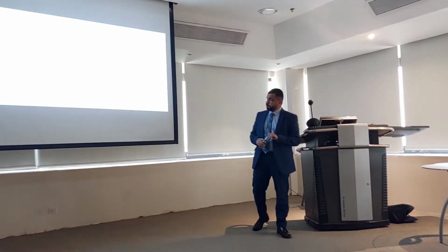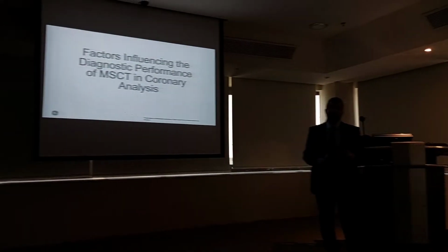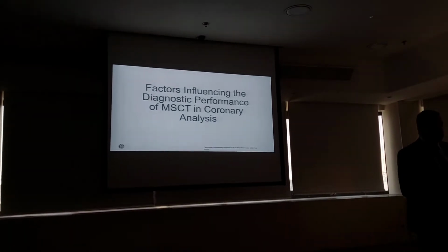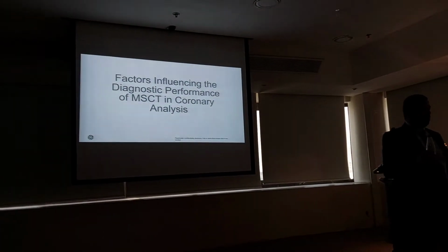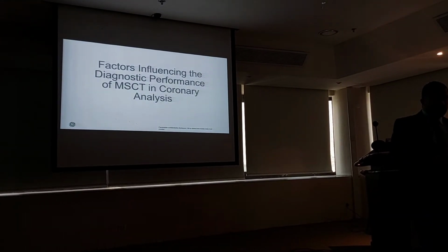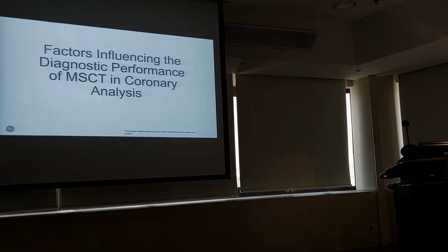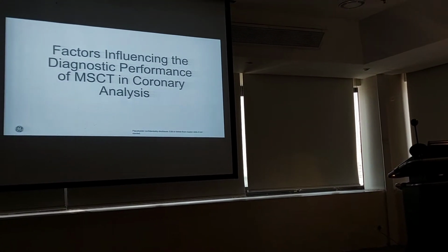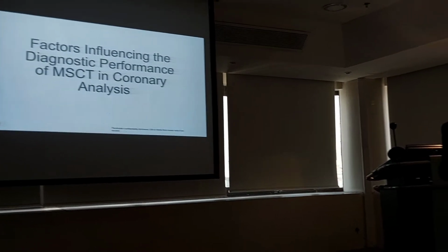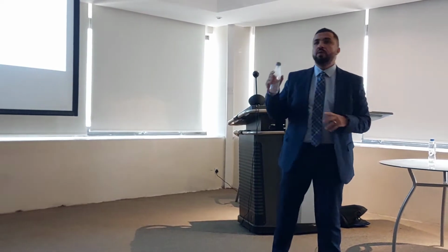So, factors influencing the diagnostic performance of multi-slice CT scan. That's why cardiac CT is a little bit more complicated. It's not only us, it's not only the machine, it's not only the ability of the system as well. It's also the patient, the motion of the heart while we are trying to scan and be able to diagnose. Okay? So we go through this.